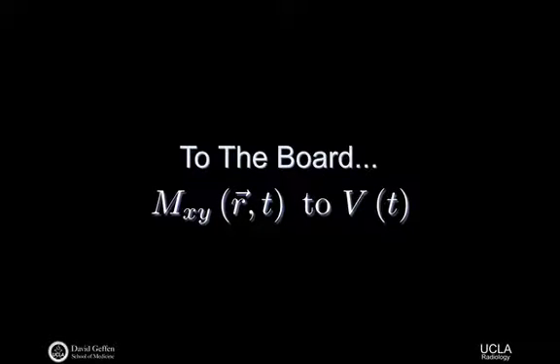And so this is your first insight to the fact that we don't really detect what's happening to the Mz magnetization, right? The X and Y components are zipping around at megahertz frequencies. This thing is barely doing anything. Even if you don't like this assumption and want to write some exponential in here, you can, but it's still really slow. And so what we're sensitive to from a detection perspective is transverse magnetization, because its rate is very, very high, and also because of how, of course, we orient our coils, the coils themselves.